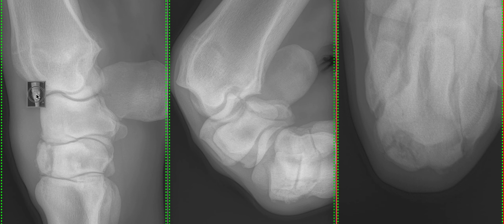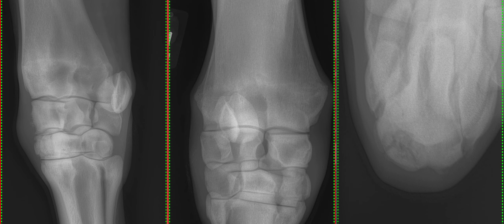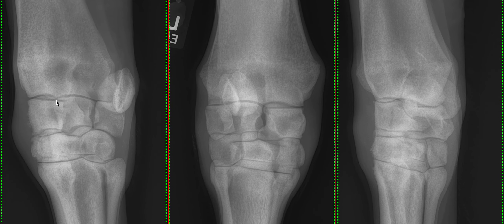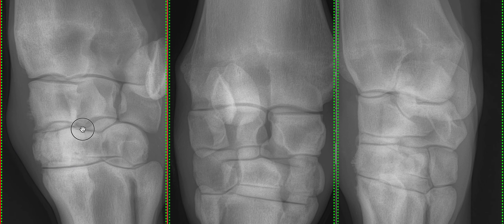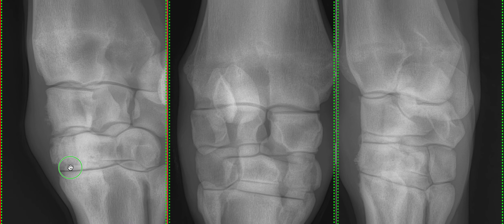Looking at our other views — the dorsolateral view on the left, the dorsopalmar view centrally, and the dorsomedial view to the right — we can again see a very pronounced middle carpal joint effusion, much more pronounced on the dorsomedial aspect of the joint. Zooming in, we can see fairly proliferative new bone formation on the dorsomedial central aspect of the radial carpal bone, periarticular new bone on the middle carpal joint, and also on the carpometacarpal joint.